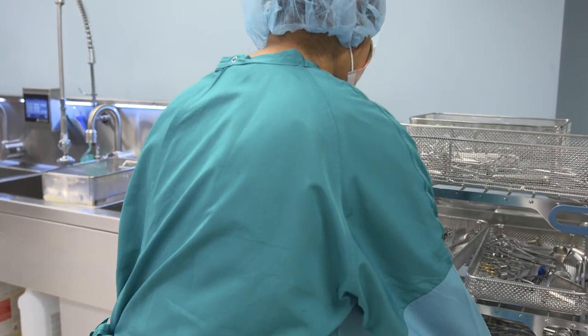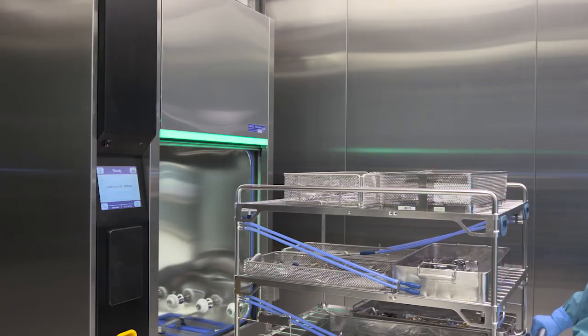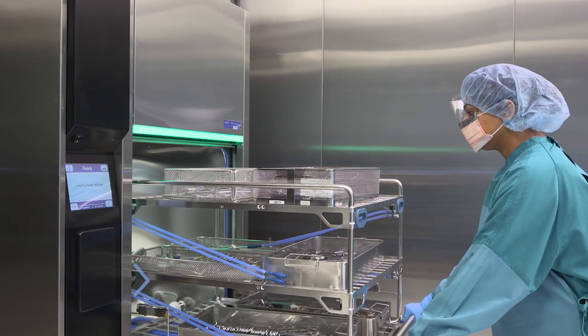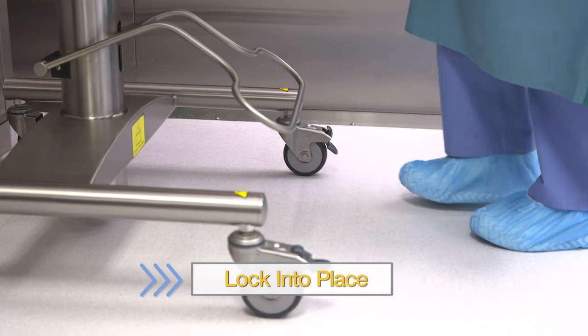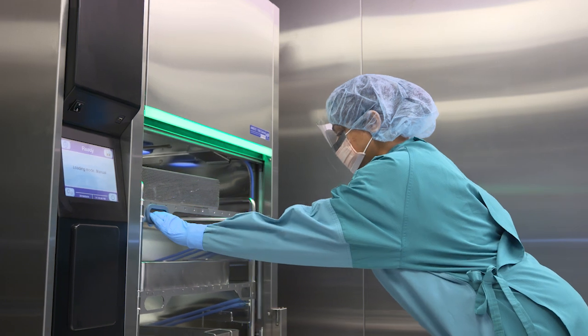Now you can load the rack onto the transfer cart. Lock the transfer cart into place and carefully load the rack into the chamber.